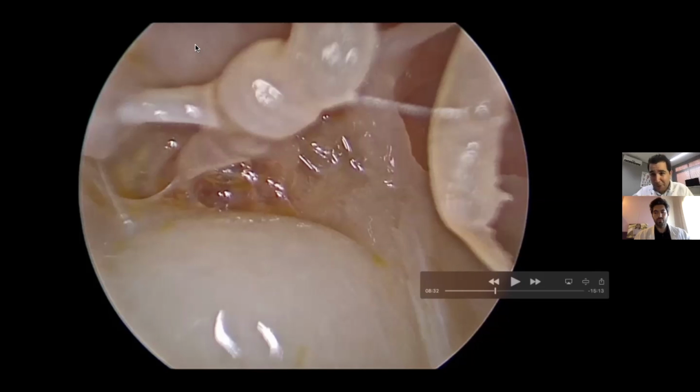So this is very important to me, and it's the second thing I always try to look for during surgeries. The first thing is the oval window, the round window, because it's a very reliable landmark. And the second thing is the facial nerve. And once we find the facial nerve, the surgery is very, very much more secure to perform. You have to remember, when you go from posterior to anterior, or from a retroauricular incision, mastoidectomy, to the middle ear, you don't see the facial nerve.